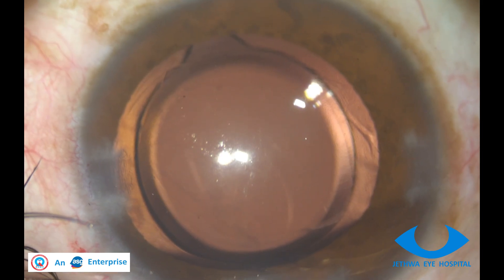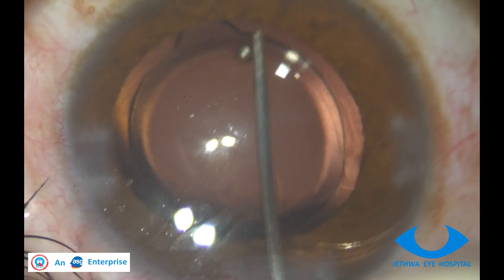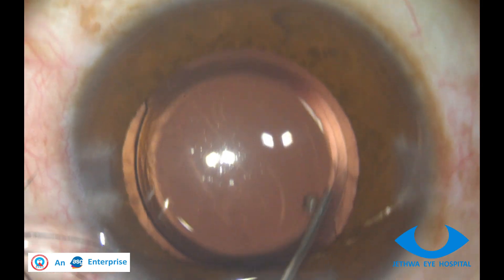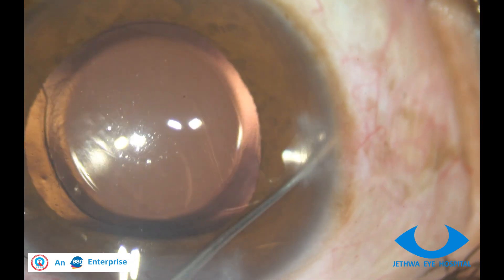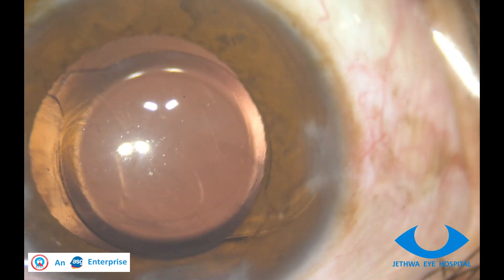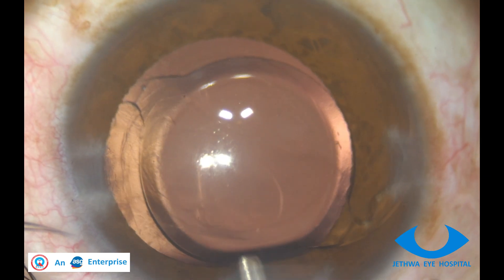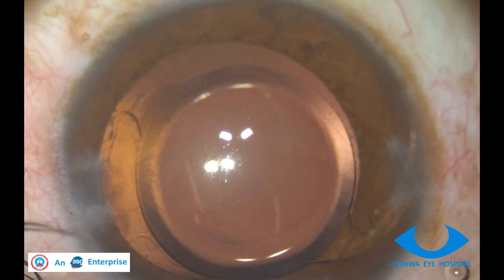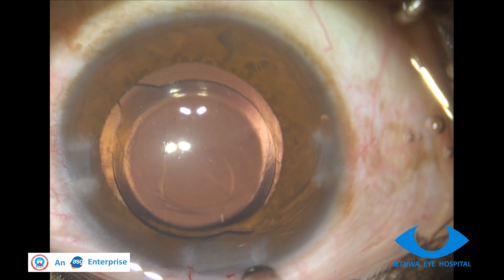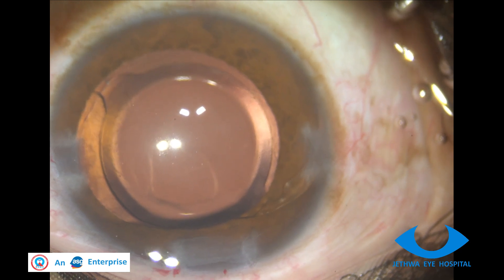After injecting additional methylcellulose, the trailing haptic which is in the anterior chamber is pushed back. You can see here that the first attempt was not successful, so I re-deepen the anterior chamber again. There should not be any leakage of methylcellulose when you are trying to flex the trailing haptic.